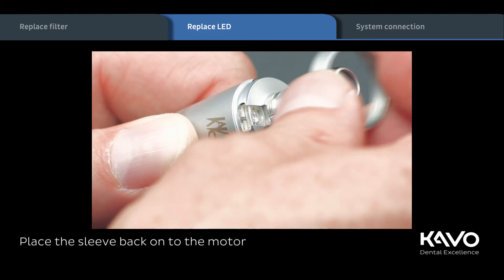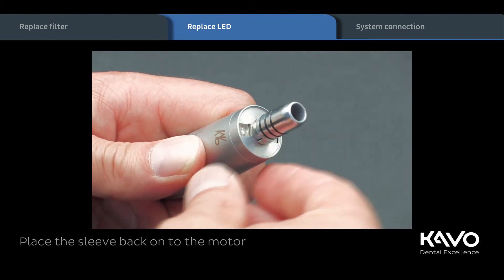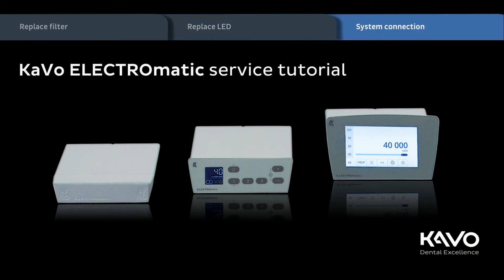Complete the procedure by placing the sleeve back on the motor. Finally, let's show you how easy it is to connect the Electromatic system.